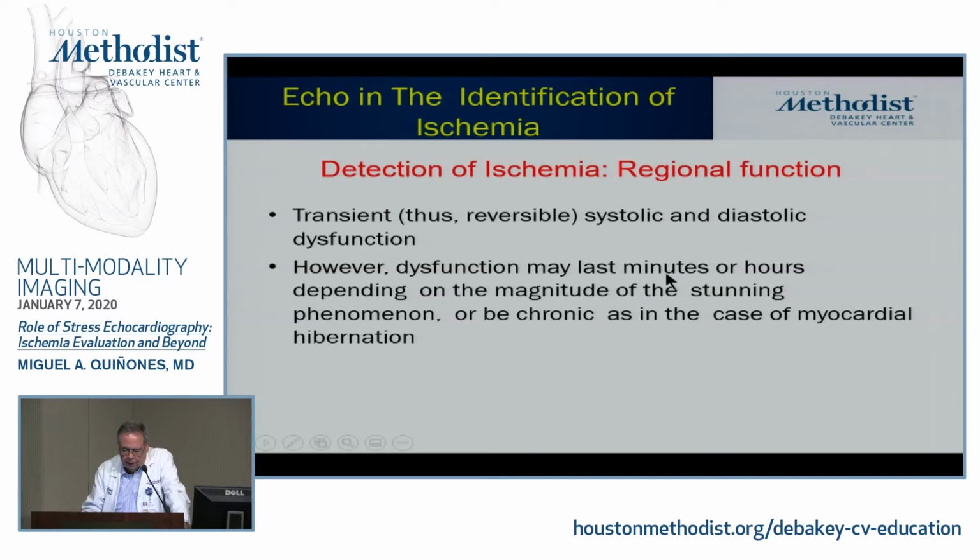So the dysfunction may last minutes or hours depending on the magnitude of the stunning, or be chronic, as in the case of hibernation. Like you may be imaging somebody on the verge of having unstable angina, and you may be seeing a lot of wall motion abnormalities.